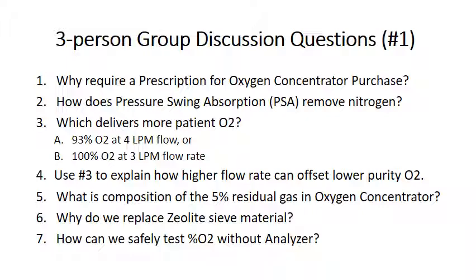Many of you may know already much more about oxygen concentrators than your instructor. This will give you a chance to show your knowledge. Answer these 7 questions in your small group and then elect someone from your group to report your results to the class.